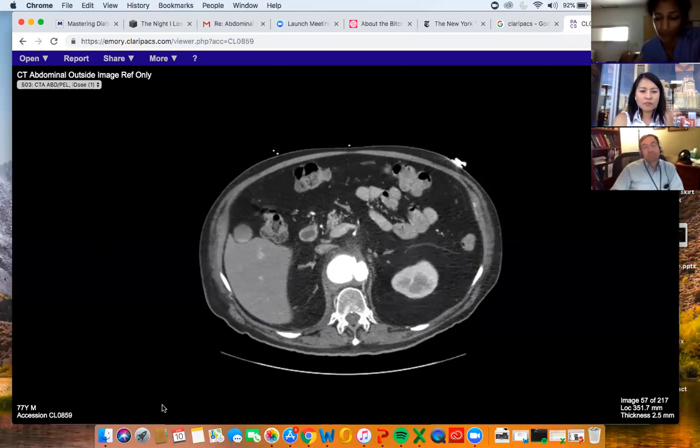So you need to treat it rapidly. You have this, and then you basically have to treat the infection. Openly, you might be able to debride it, but you might not get all the infection out. So they've been doing this now with endovascular repair with a drain. And so my vascular surgeon sent me a bunch of articles about it.